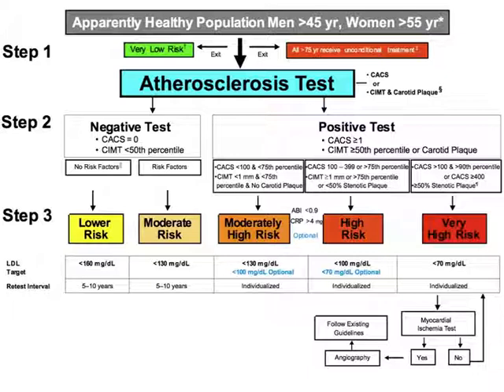But now that the machines are in the clinician's hands, if you're going into primary care, this is another great potential use. You can use it to risk stratify your patients and help direct therapy. So that's kind of the idea going on with this.